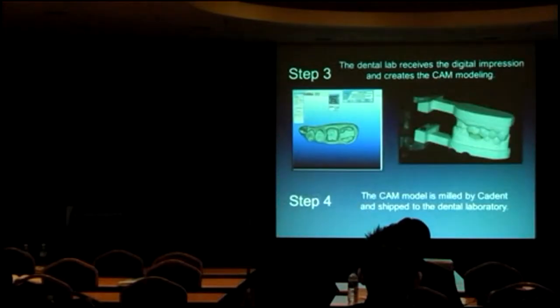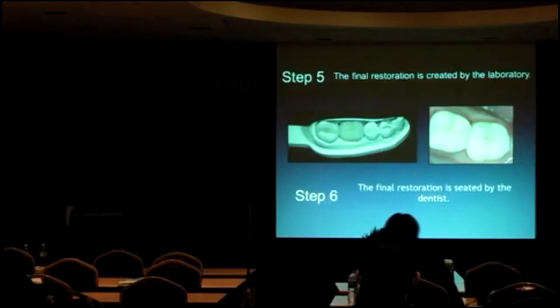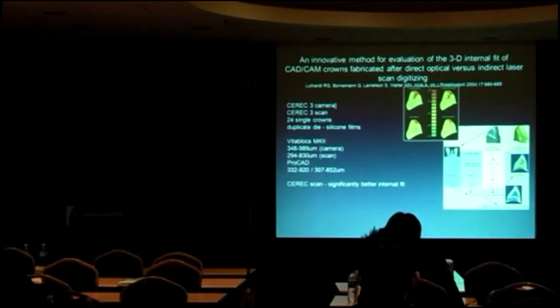Then you send the data, and it goes to the center, where they convert it to STL. You can use the data itself, and you can also fabricate the model from the data and work with conventional lab work. Then you can try it in the patient's mouth and cement. So it's very simple. But the problem is it only came onto the market in 2006, so we don't have that much evidence.